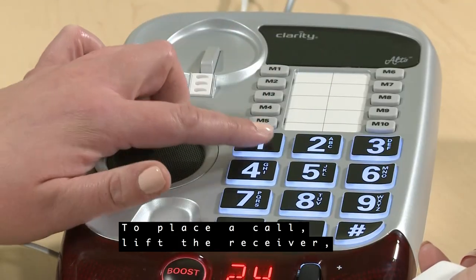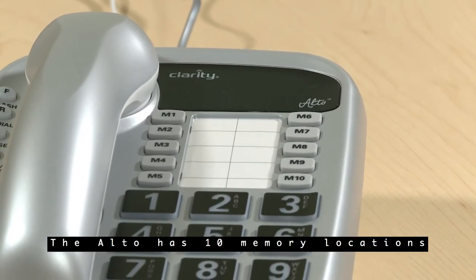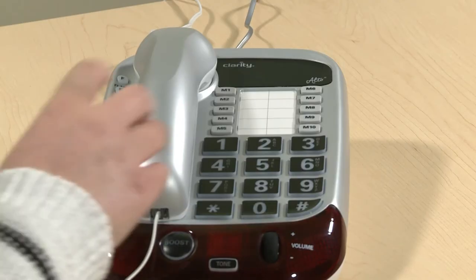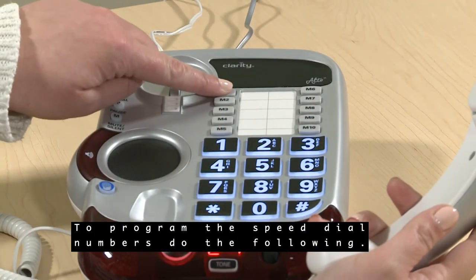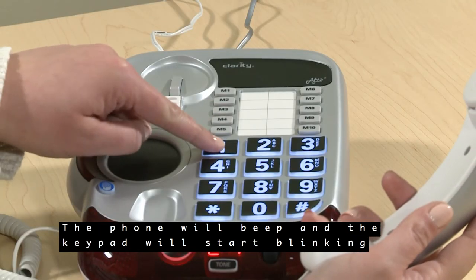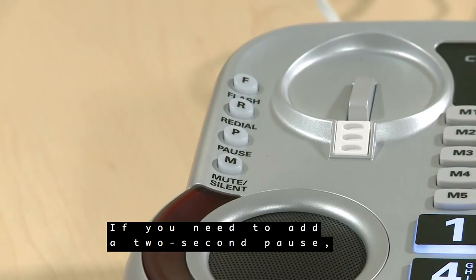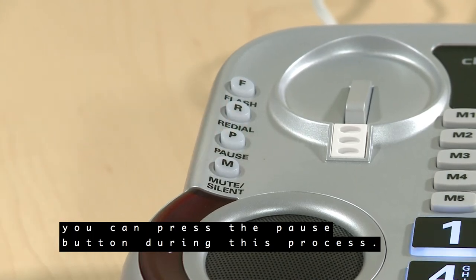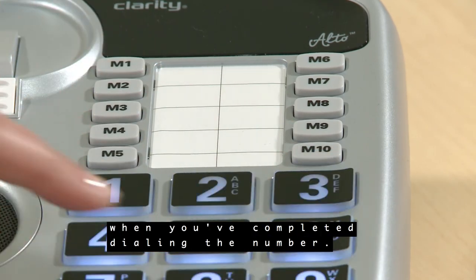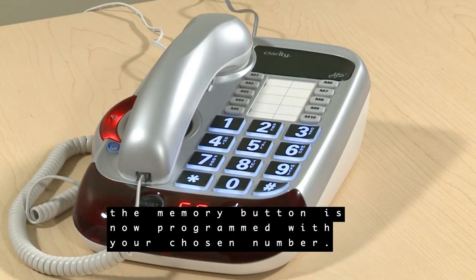To place a call, lift the receiver, then dial the numbers with the numerical pad. The Alto has ten memory locations for frequently called numbers, accessible from the memory keys. To program the speed dial numbers, press and hold the desired memory location key. The phone will beep and the keypad will start blinking to let you know you're in memory mode. Enter the phone number you'd like to store. If you need to add a two-second pause, you can press the pause button during this process. Press the same memory location key when you've completed dialing the number. The phone will beep three times to let you know the memory button is now programmed with your chosen number.